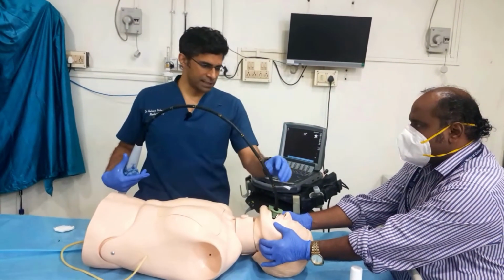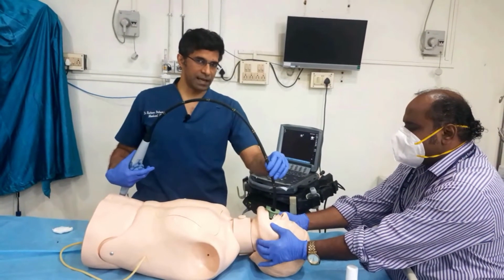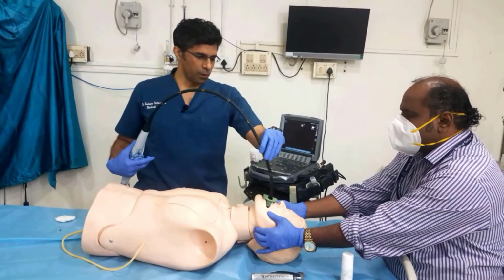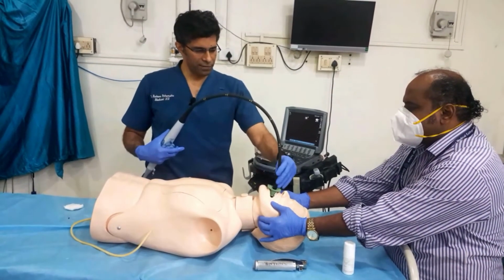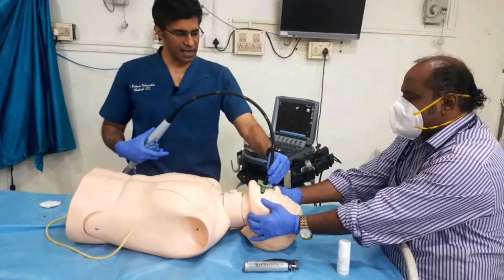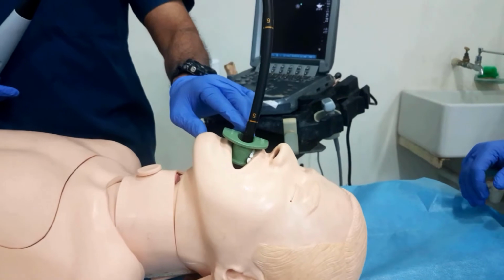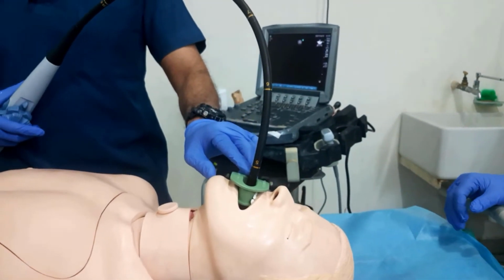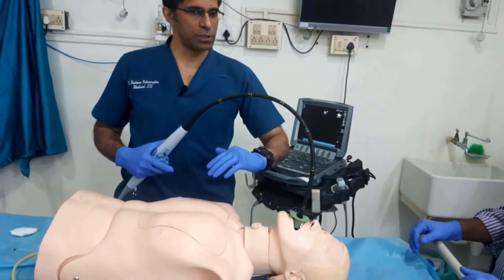Okay, now that we have inserted it, let us move to the first view. The first view is a transgastric short axis view. So we push the probe in all the way to about 45 to 50 centimeters. You can see that it's about 50 centimeters in now. The tip of the probe is in the stomach. Okay, once this has happened, we need to make sure that the probe is moved to the left.